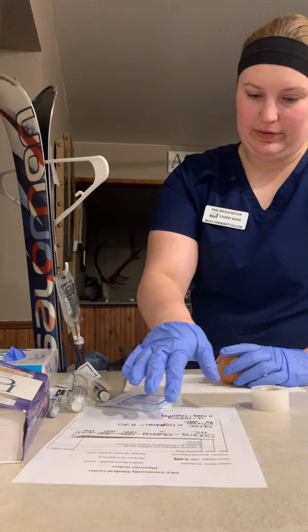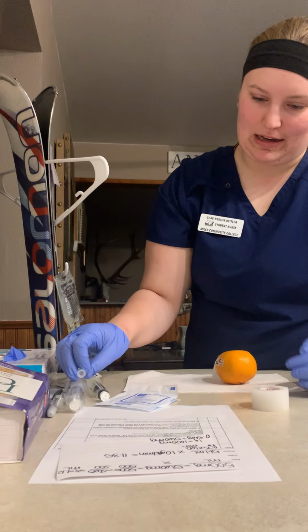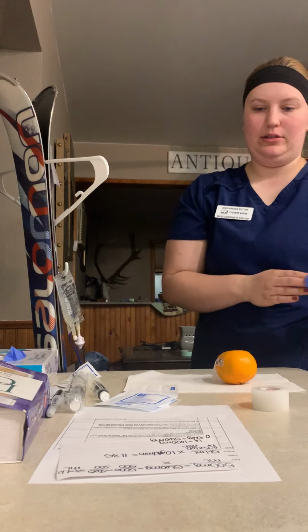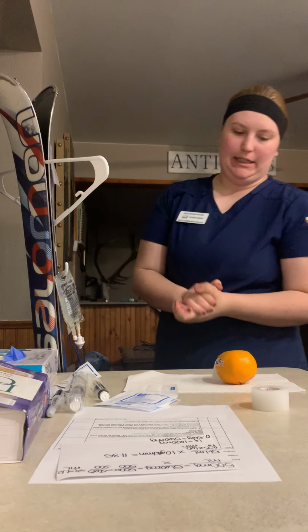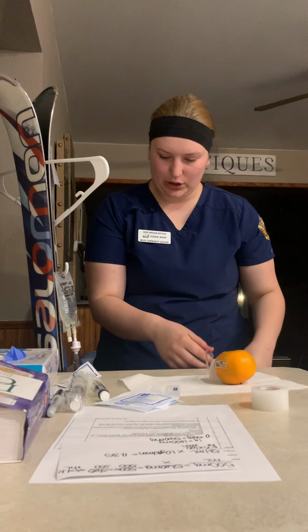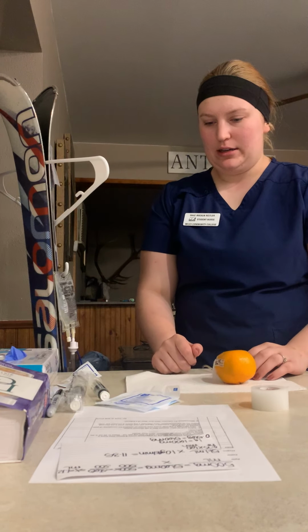And that is over 45 minutes. And you're giving 4 doses, so once every 8 hours. Take off my gloves, wash my hands. I'm gonna make sure that lines are running. And then again, just check that IV site.